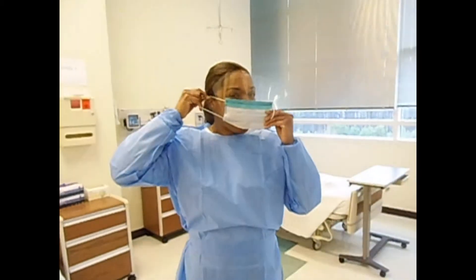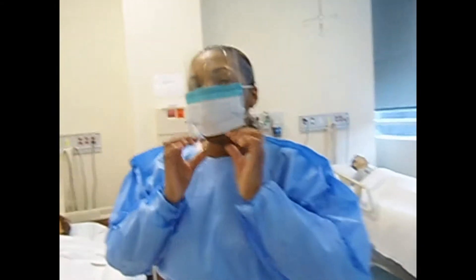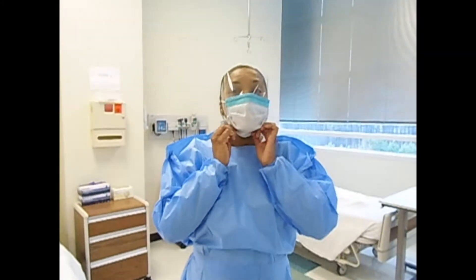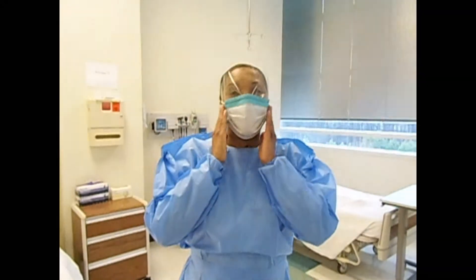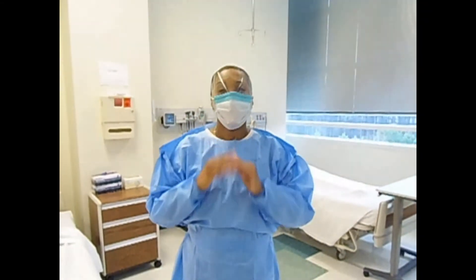To apply the mask, place the elastic over the top ear, then pull the mask down over your chin. Make sure the nose bridge area is firmly pressed and the mask is snugly over the face so that no infectious material can get in.